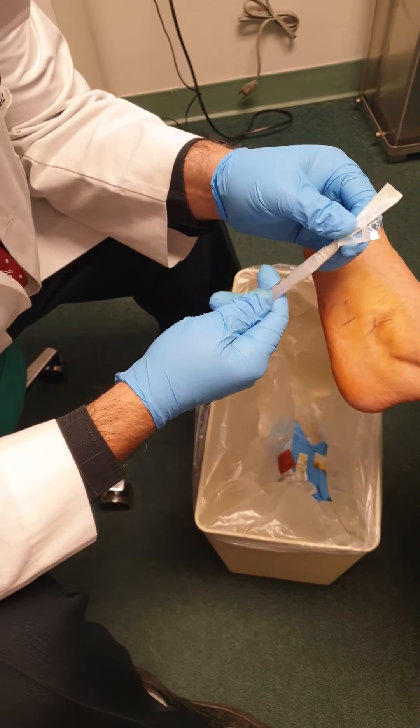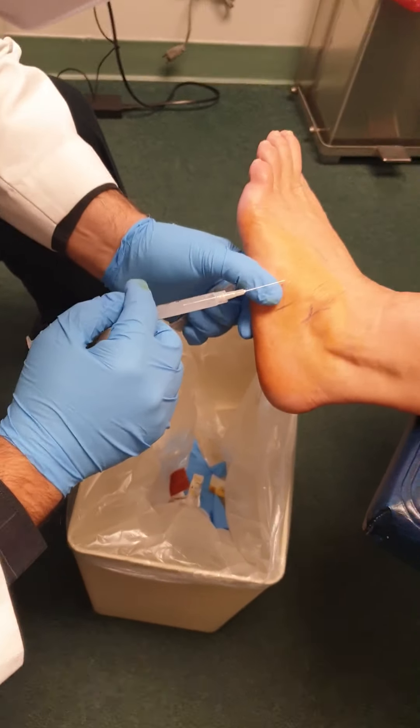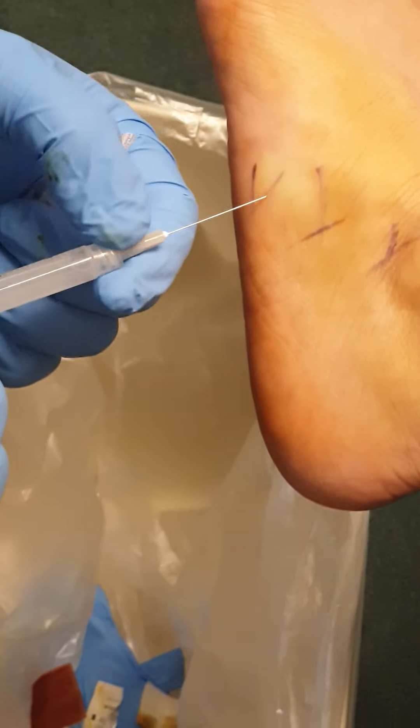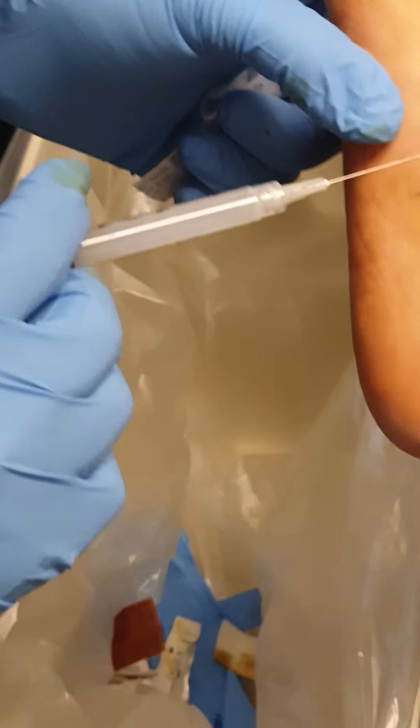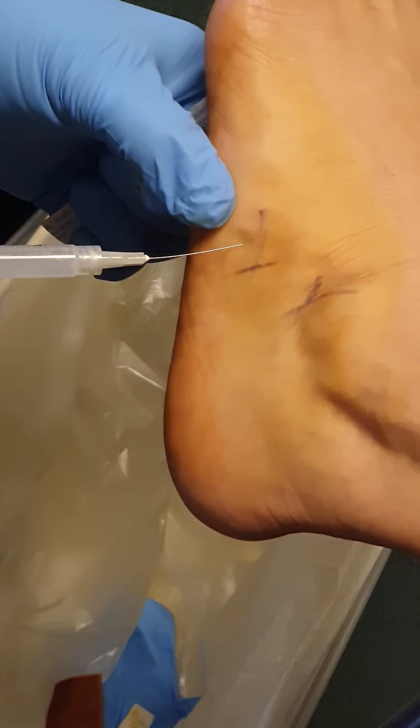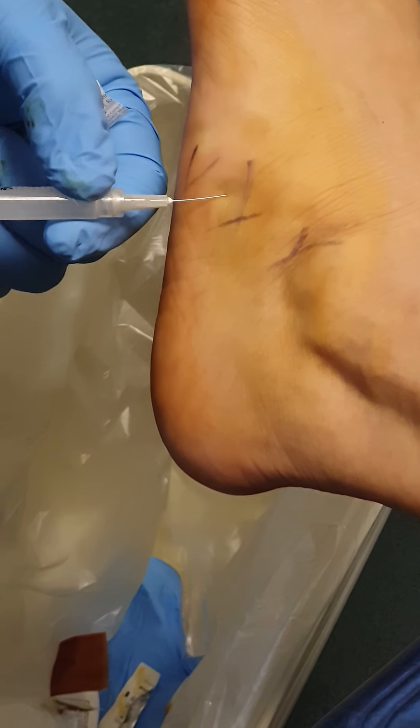We use a very fine needle. We inject right into the area of pain and then distribute it — we fan it up. Deep breath in and out. There you go. Here we go, going in right now. You feel that too much?